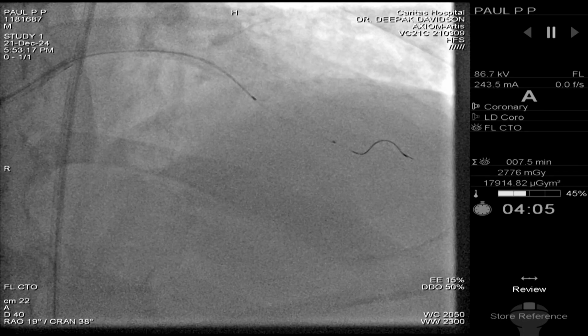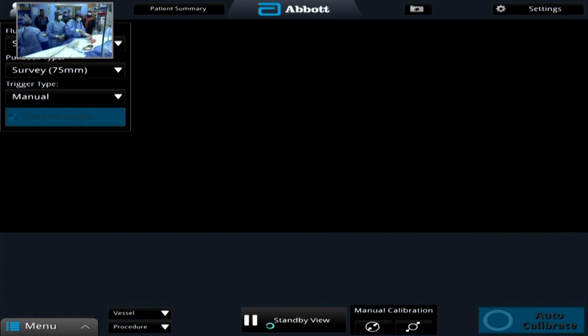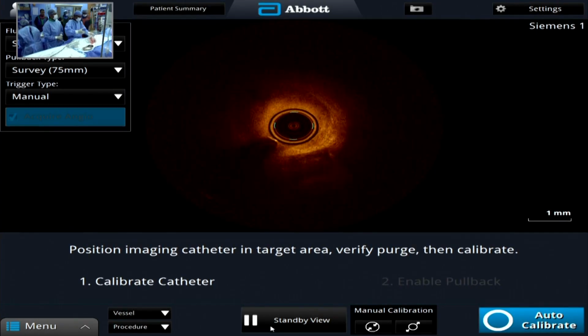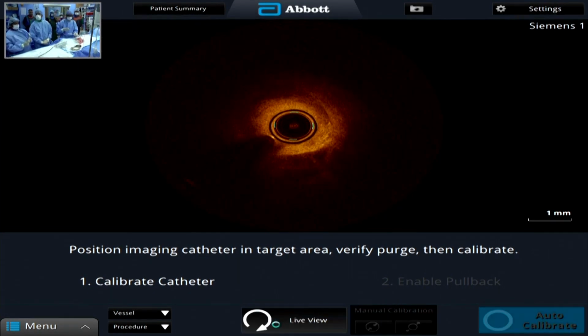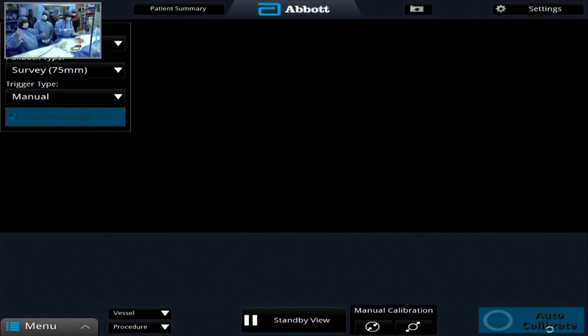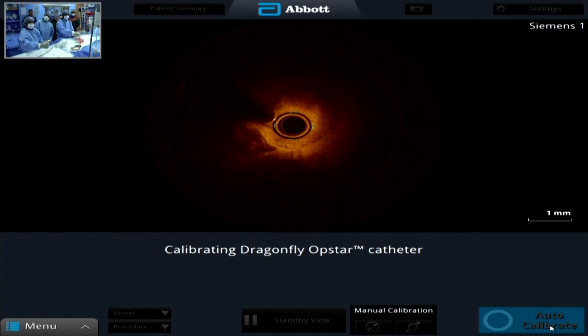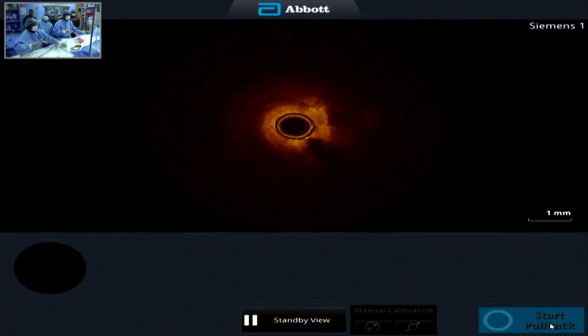Oh, yeah, that's saline. Okay, then give that. Okay, ready? Saline, but then we'll have more of saline here. Okay, I take 50. Okay, ready? Jojo, you should activate it.